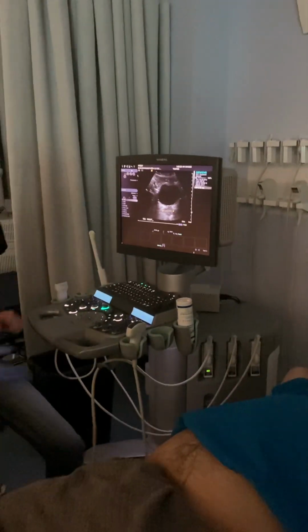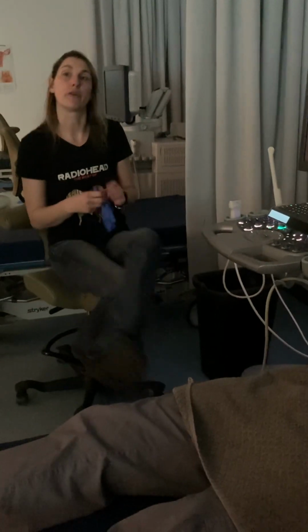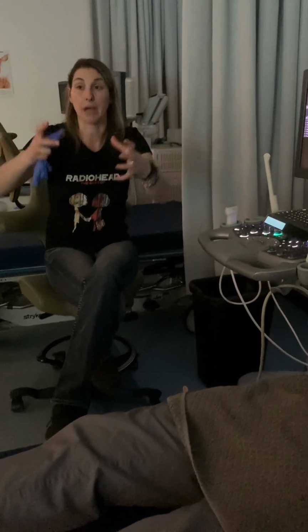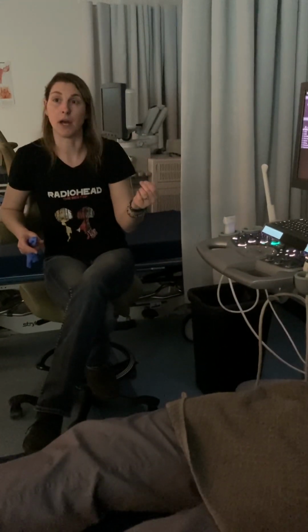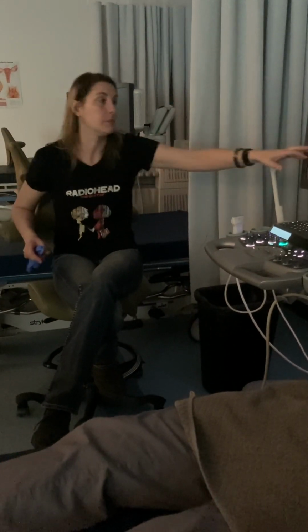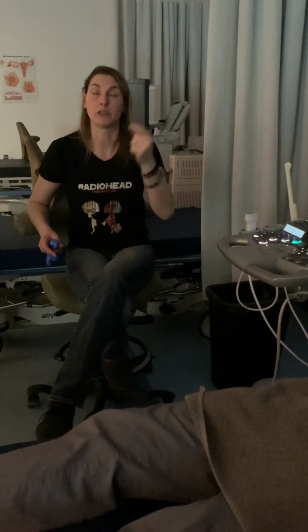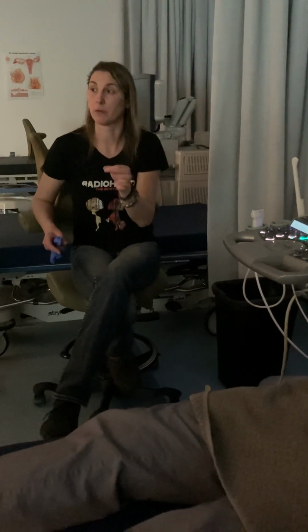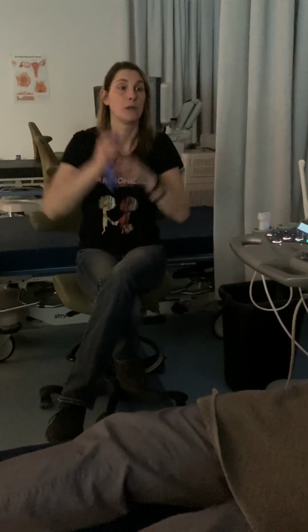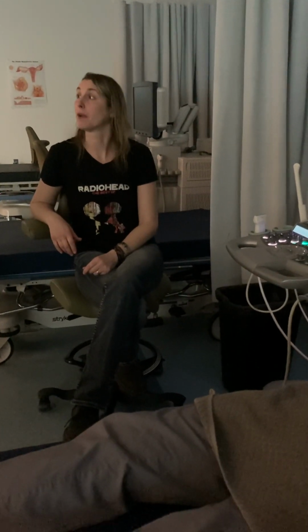So now if I had something abnormal in there, calcifications, so if I have a patient who has bilateral hydronephrosis, so something's backed up from the bladder down, and I may still have jets, but I don't see any stones within the bladder, I may go down to that prostate to see if I can identify a foci within the prostatic urethra. Like maybe there's a stone that migrated all the way down to that prostatic urethra and it's causing bilateral hydronephrosis. But we don't check penis for stones? If I don't see anything, you could continue to go. Yeah, you could go all the way down the urethra.